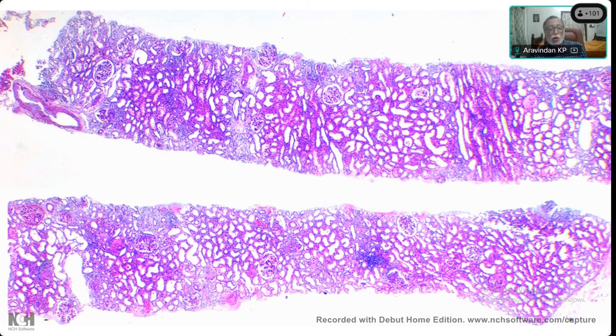Okay, so that's one of the things. Some degree of inflammation is there. So, interstitial inflammation. You have some pockets of inflammation you can see here. Yes. Okay. And what would you think of the size of these glomeruli? More or less normal? Yes, sir, normal. Okay.